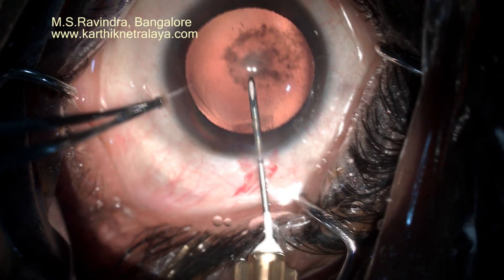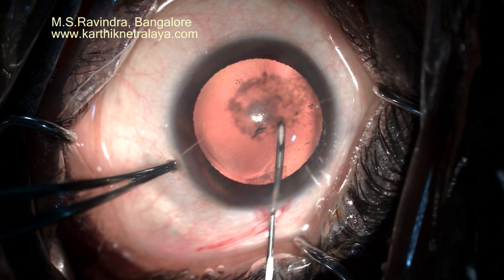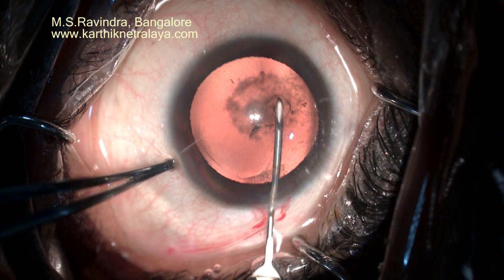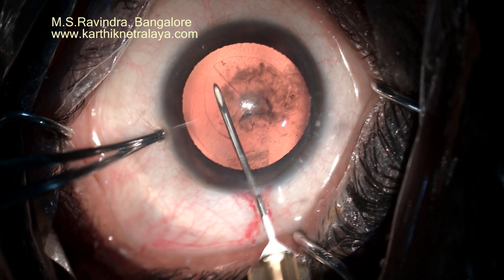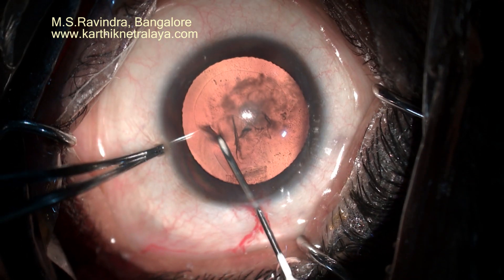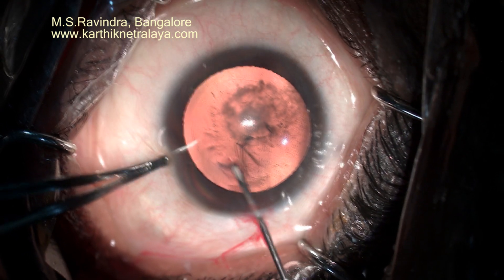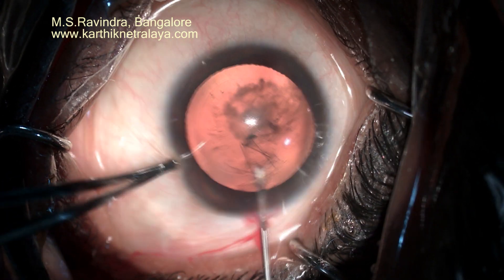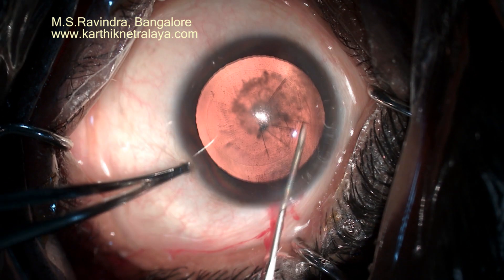A tunnel floor entry method uses a cystitome to create a rhexis through a stable entry chamber. The chamber is deep because it is filled with viscoelastic. Visibility is very good. There are no wrinkles in the cornea, even in the proximal zone where the tunnel is made, because you entered the chamber through the floor of the tunnel and not through the length of the tunnel.